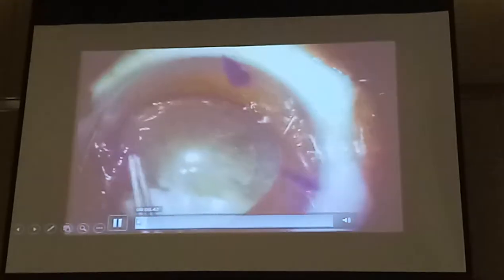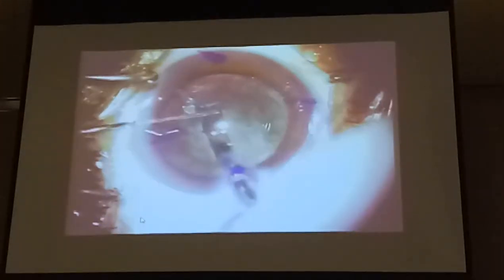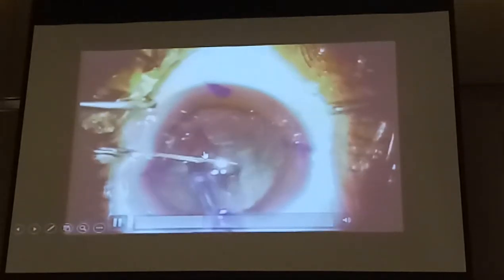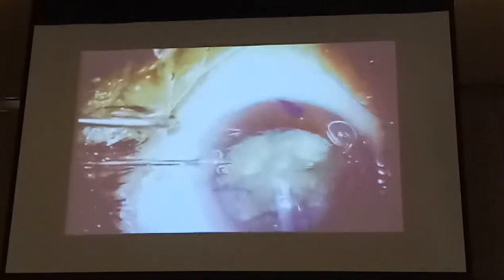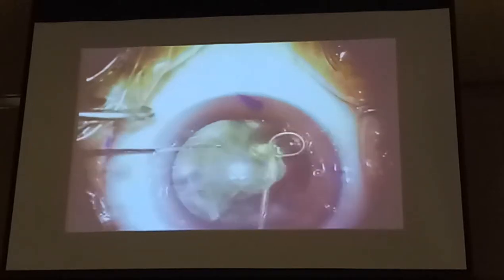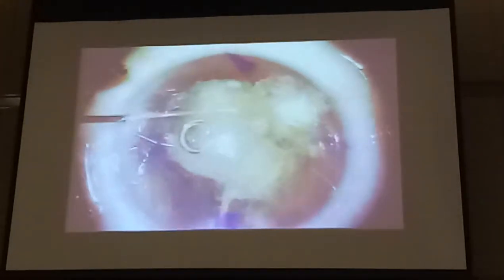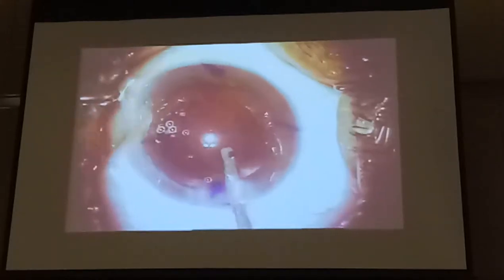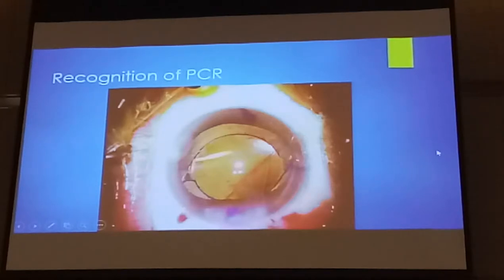This is another snap sign. I didn't think anything of it; I proceeded. I found that it didn't really rotate well. I managed to rotate it, but after impaling it and continuing the phaco, it's just not right — it's tilting. The whole nucleus is tilting. This was a strange cataract in a young patient — a lawyer. That's how I mobilized it into the OVD trap. Then I proceeded to remove the nucleus and there was one dropped fragment. That's when I got my PCR column in. You saw that severe posterior capsule snap sign.